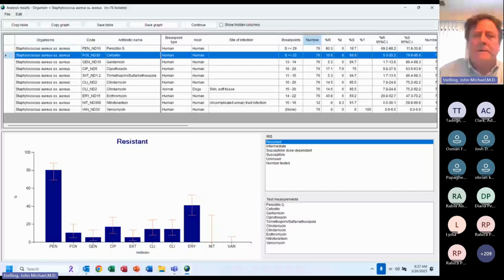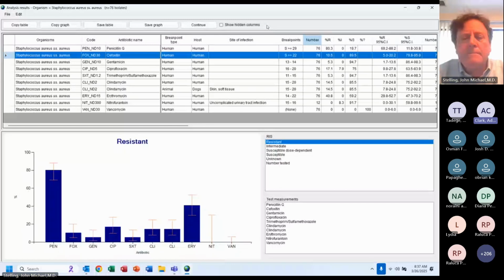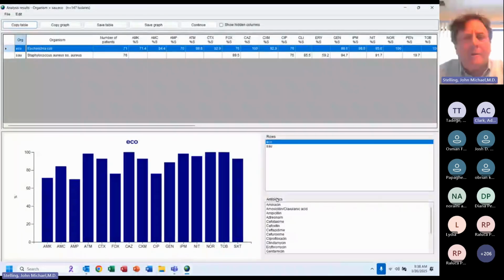I'm now back at the main screen. I'm now going to go to analysis type and put number 2, summary. When I click on summary and I click on OK and I click on begin analysis, Adam, do you see my output table? We briefly saw it flash there. I think we still see you setting the options, and now we see the output. Okay. I'm not going to stop on every screen because of this delay, but hopefully by now you've seen it's very straightforward.